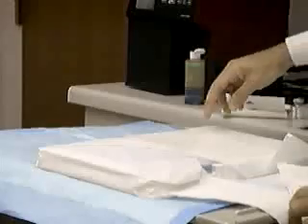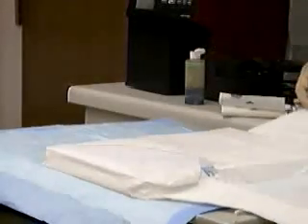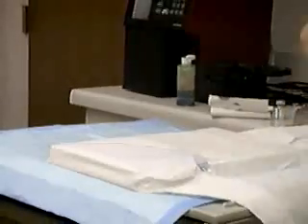Now open your spinal tray. Everything inside the outer package is sterile. You can unwrap the first three layers before you put on sterile gloves. Most pre-packaged lumbar puncture trays contain a standard 20 or 22 gauge, 3½ inch spinal needle, a manometer, stopcock, gauze sponges, sponges to apply the antiseptic, specimen containers, local anesthetic, syringe, 25 and 22 gauge needles to inject the anesthetic, plus a band-aid.